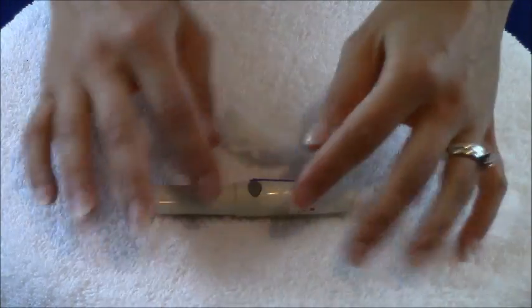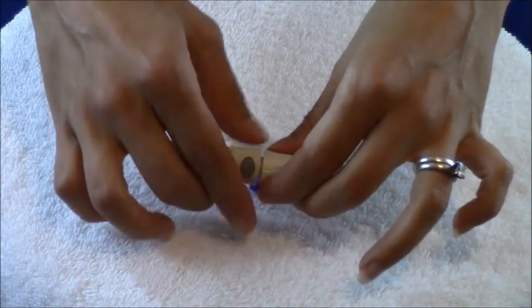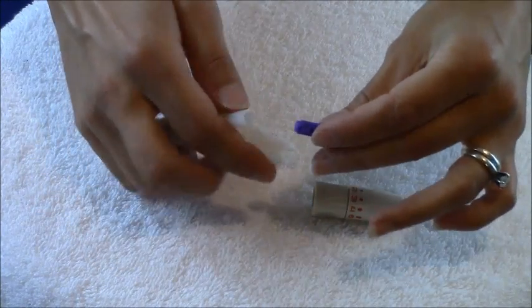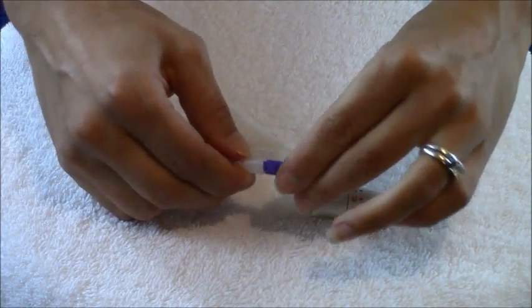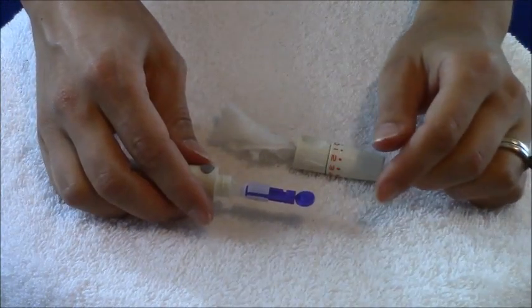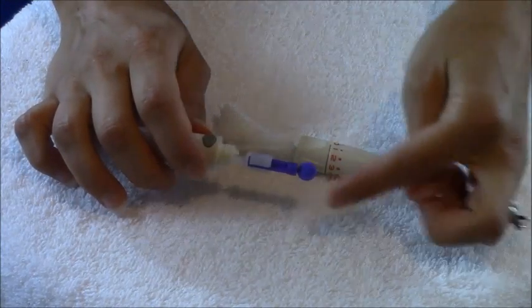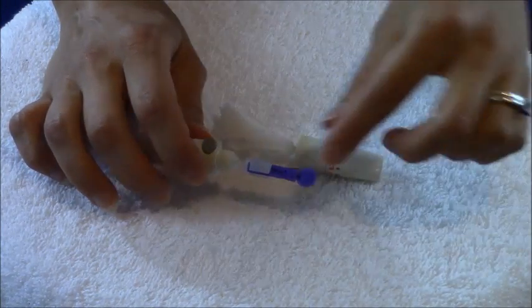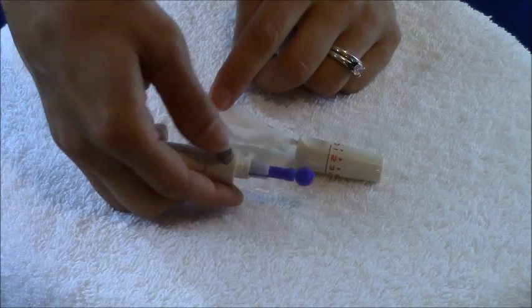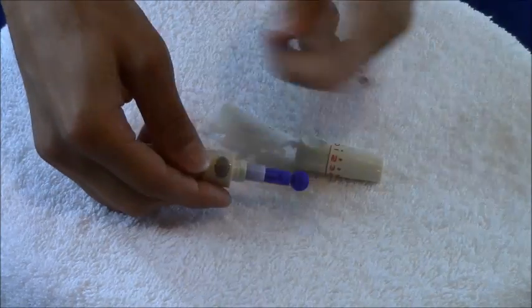Yours may look a little different but should work the same way. You twist this part off, take your lancet, find the grooves on it, and slide it just inside the device. Then engage the needle — I like to say engage the needle before you expose it because you could poke yourself, which contaminates it.